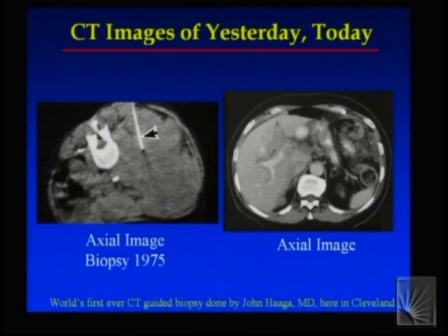So let's go back and look at another imaging technology for just a second, so I can continue to highlight how Cleveland pushed the innovation of some of these fields. The first whole body CT scanners that use X-ray technology came out in 1972 from a company known as EMI. And who knows what EMI stands for? Electronic Musical Instruments. Okay, and you may say, how is it possible that a company that makes musical instruments came up with the first CT scanner? Basically, perversity of nature, and it happened.